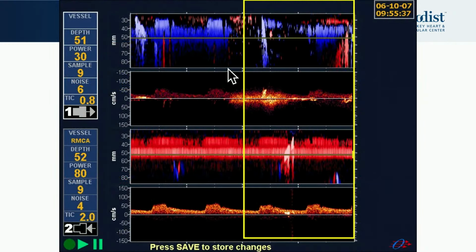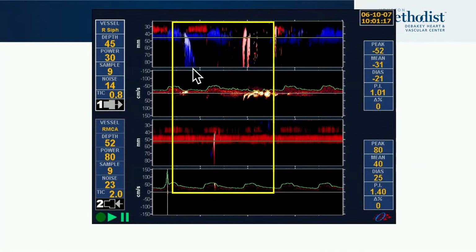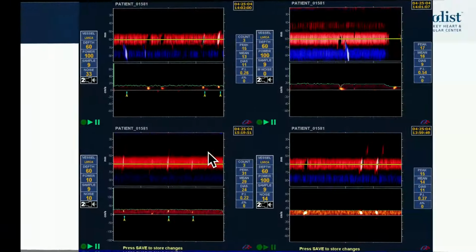Sometimes what was really funny, when you are counting one going up, sometimes we see two coming out. 1, 1, 2. Who knows what happens under the pressure, getting a bubble into a bifurcation, maybe divided into 2 bubbles, and it was 2 bubbles coming out, when just 1 bubble was going in.